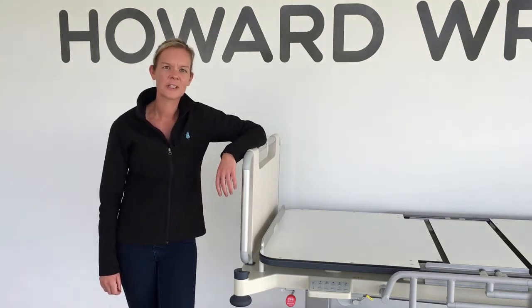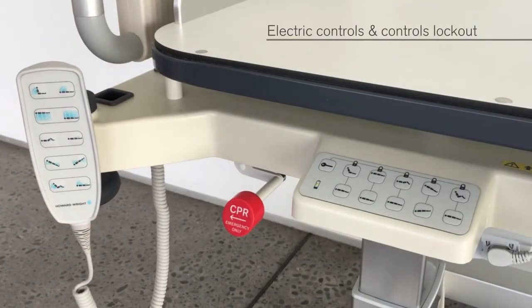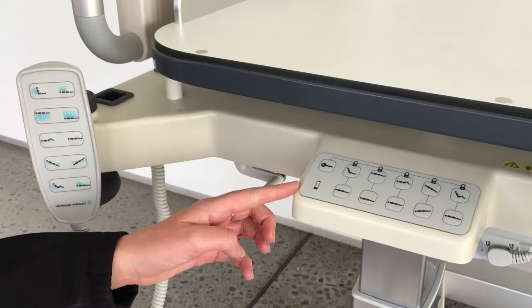There are two methods for controlling the bed. The first method uses the handset at the head end. The second method uses the attendant control keypad located on either side of the bed. Each keypad has the same functions as the handset but also includes a lockout function and a battery indicator.